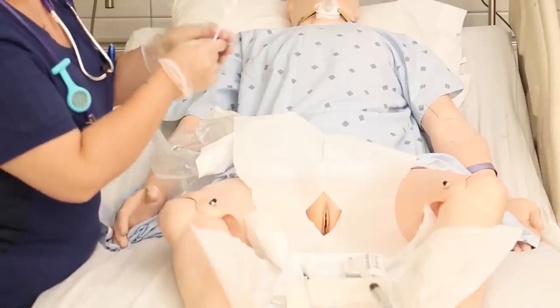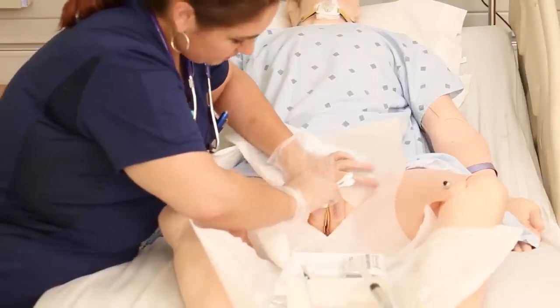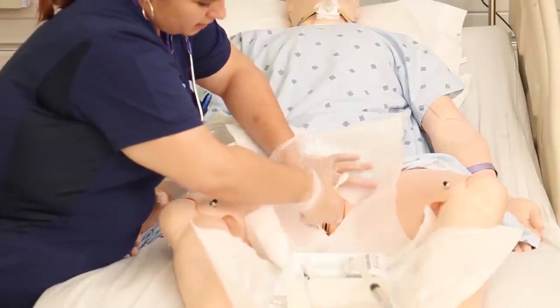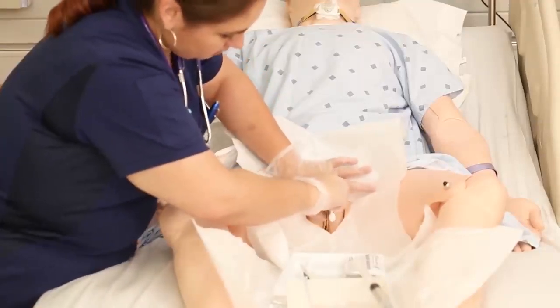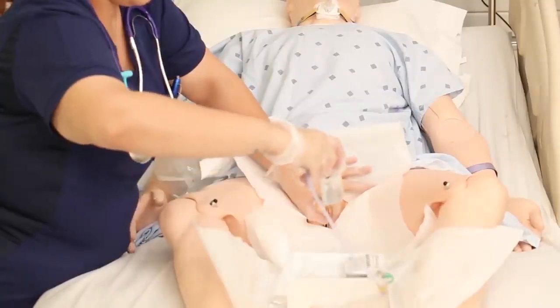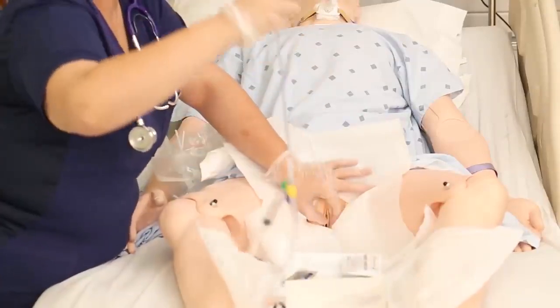Let the patient know you're about to touch them or that they'll feel something cold. Use your non-dominant hand to spread the labia and hold them open — once you do this, that hand is no longer sterile. Cleanse the meatus, always moving front to back: right side, then left side, then down the center. If you have an extra swab, go down the center again. You're looking for the 'wink' of the urethral opening as you cleanse. Don't put used swabs back on your sterile field — use the trash bag for those.